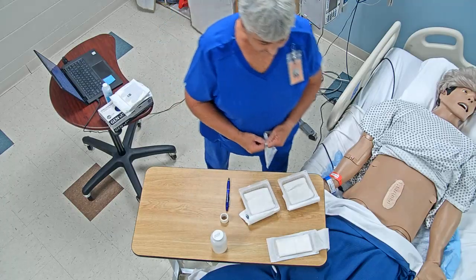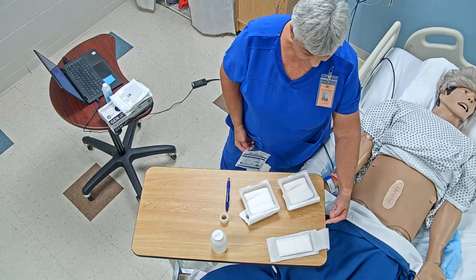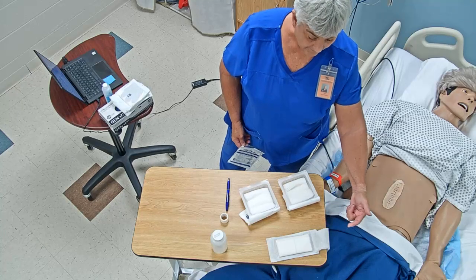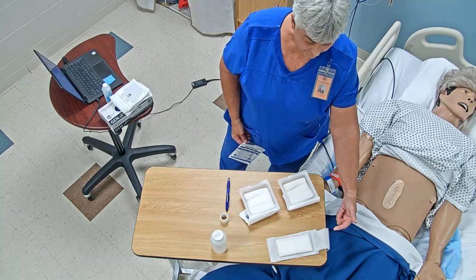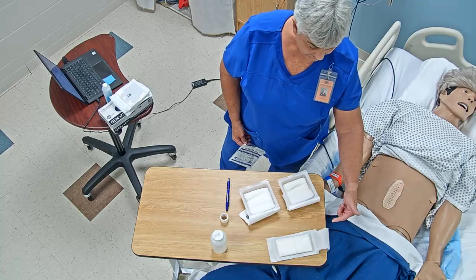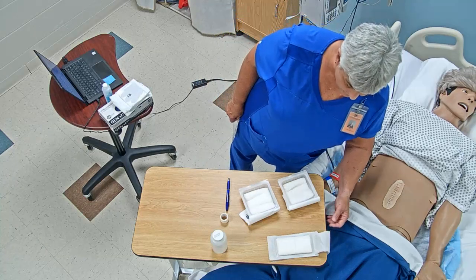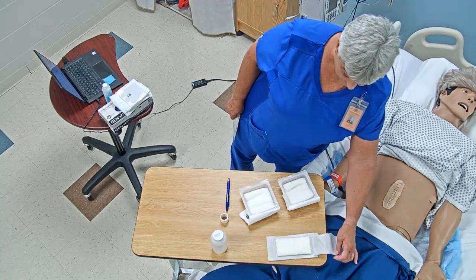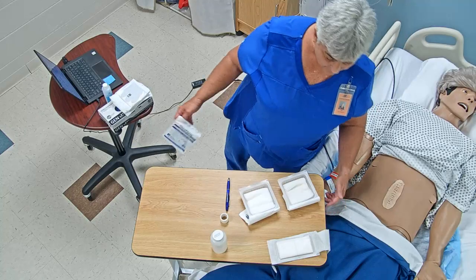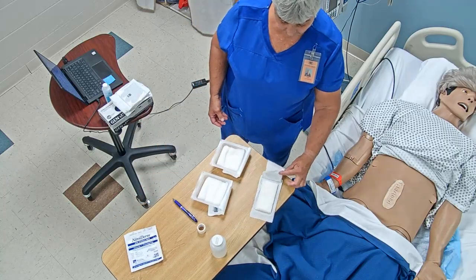Now, do note that when I open this package, the edge of that package is touching the 4x4, or the ABD, but that's the outside of the ABD. If it was touching on the inside of the ABD, we would need to get a new one. And so that's just something you need to evaluate when you're opening that. So it doesn't look like it's touching on the inside, it's just touching on the outside. But if we had any doubts, then you can always throw it out, okay?